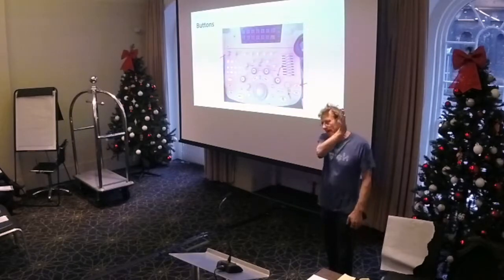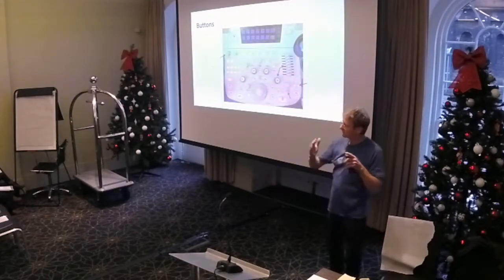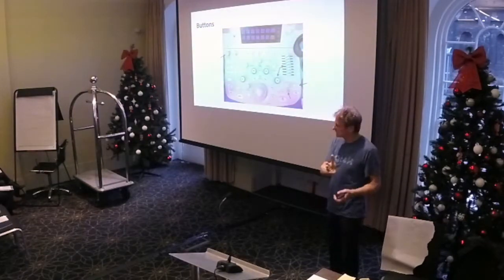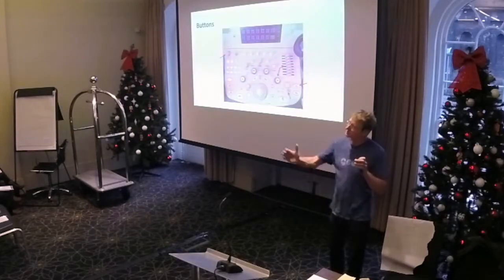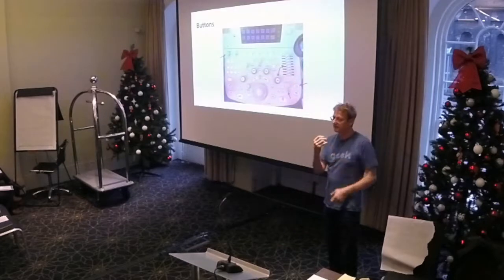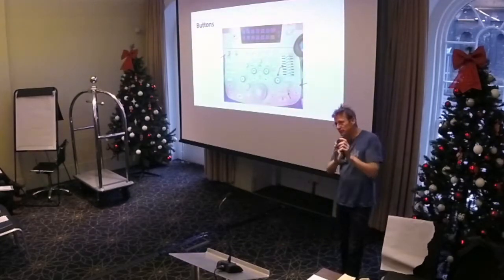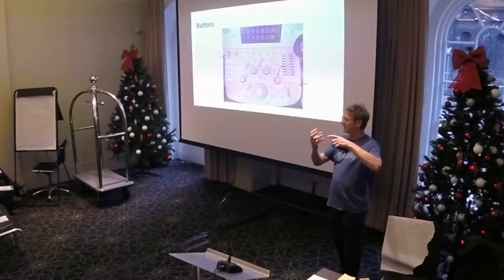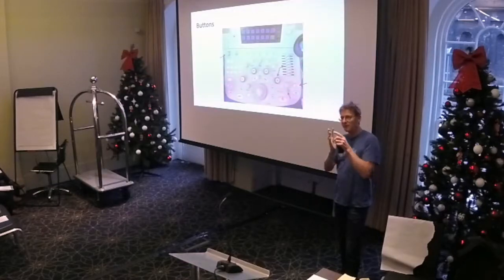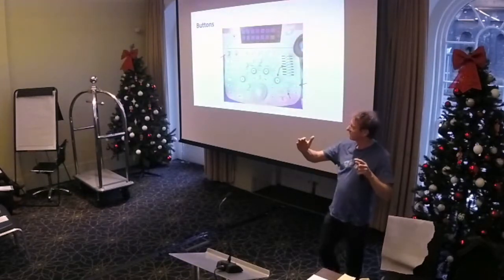And be aware that each sweep is then amalgamated into one frame, and you can adjust that, and that's what your sonographers are doing. In various machines it's called persistence or various other stuff. So very often the machine will do 4 or 5 sweeps, form one composite image, and turn that into a frame of a video. And the reason you do that is that you get greater image quality. But if you've got something moving very fast, like a heart, then it blurs it because the heart's moved even in that time where the sweep has gone across.